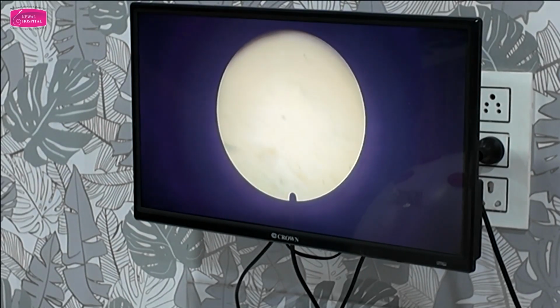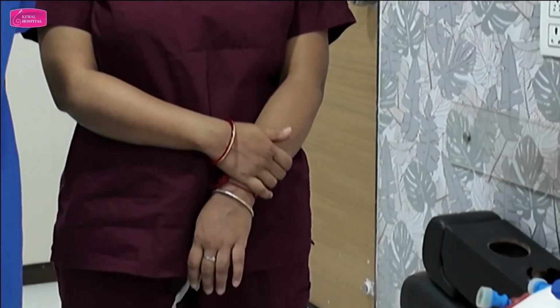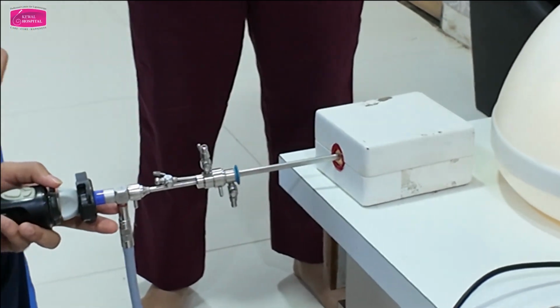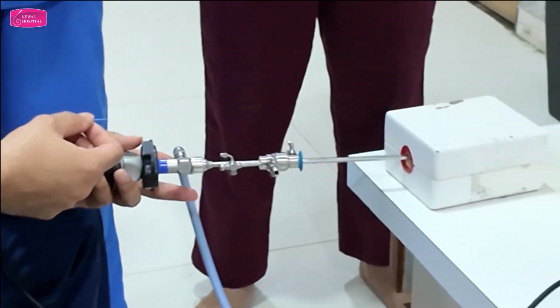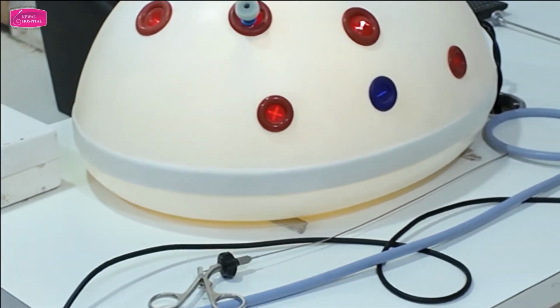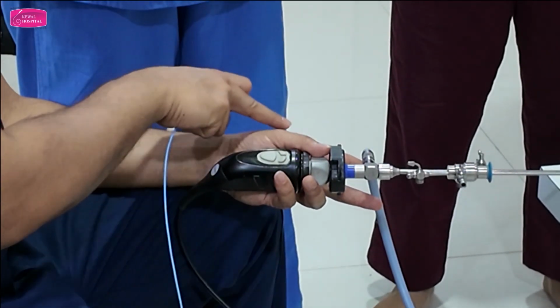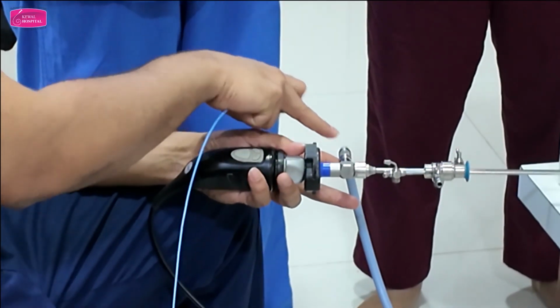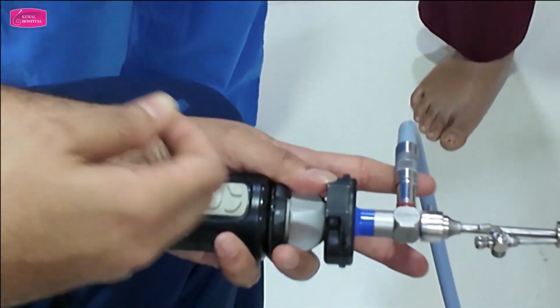Sure. He has brought the cannulation wire, so let me show you the cannulation. Again, you have to stay close here. Correct? And then introduce it. Look at my finger. Look at how my finger is supporting the light cable, and the camera is facing up.